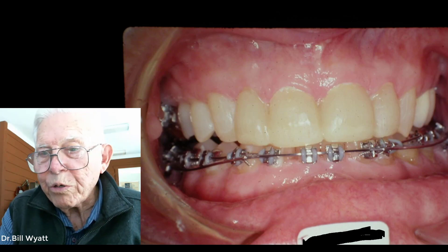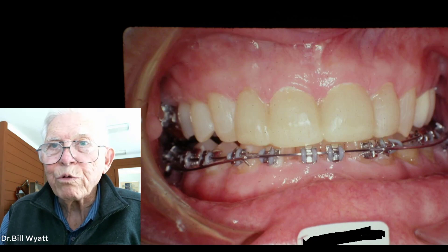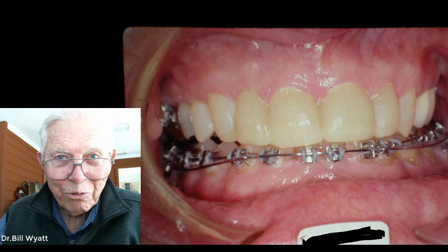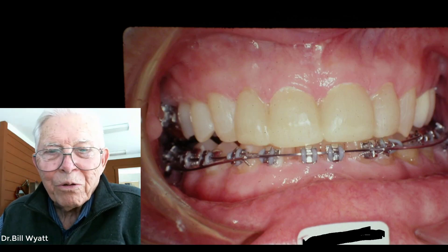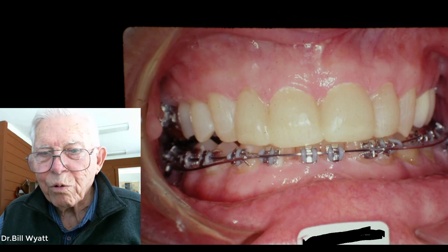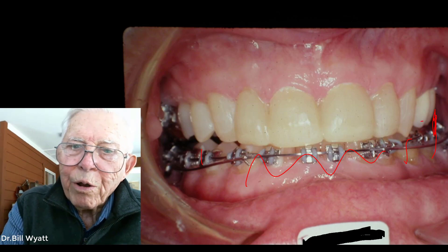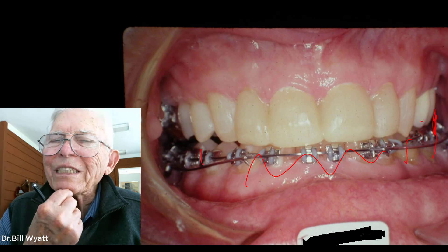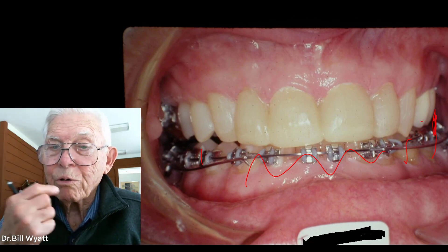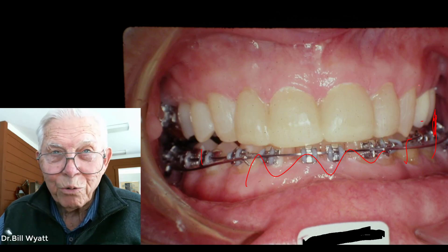We built these teeth up, but we couldn't make them arbitrarily at a certain height. If you get them too long, then when the person is talking or moving their jaw, the teeth would come together — you learn that in making dentures. So we added a little bit more to get some length to these teeth. We're lowering these teeth here and these are coming up, so his distance between chin and nose is going to increase slightly, but you won't notice it much because it doesn't increase very much. But if somebody was really wide open to start with, you wouldn't want to do it that way — you'd want to put pads in the back and work on it.